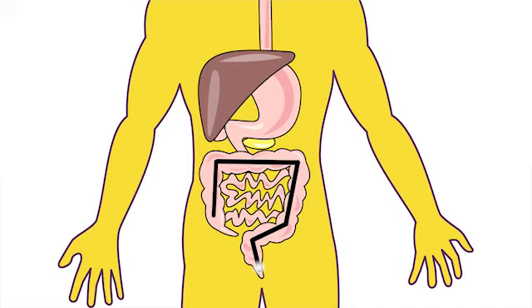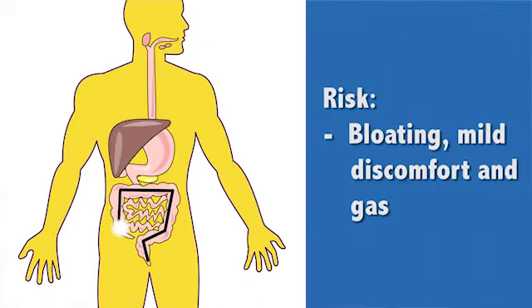With colonoscopy, air is sent through the endoscope to dilate the colon. This allows for better pictures. This can cause a sense of bloating, mild discomfort, and gas after the study.